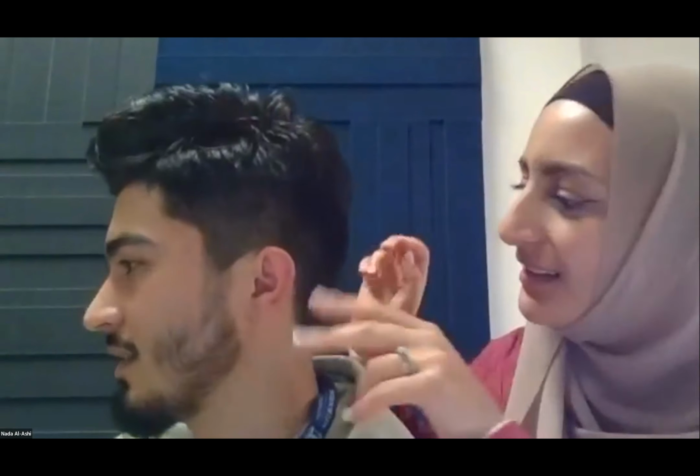Okay, so a collapsing canal is pretty much, I'm just going to show you guys on Hamid if you turn around. So we basically check by pressing on the ear like this. With some people, when you press on the outer region, their ear canal actually snaps shut. So what that means for testing is if we put headphones on them and we're putting that pressure on the outer ear and their ear canal closes up, there's going to be a restriction of the sound that we're presenting. And the insert earphones are the ones that can maybe hold the ear canal open for us while we're presenting the sound.